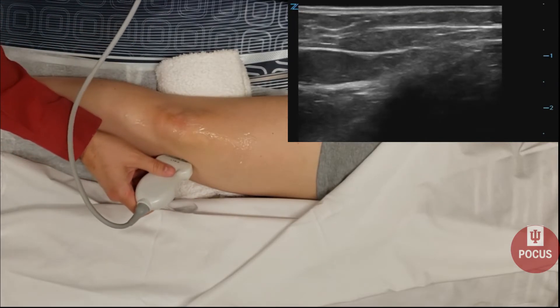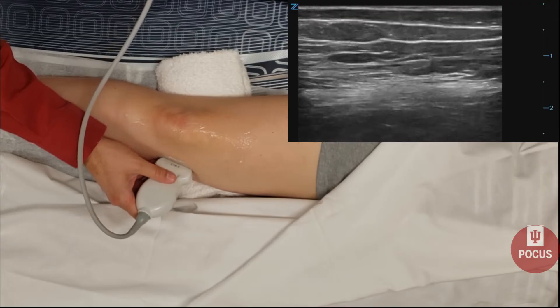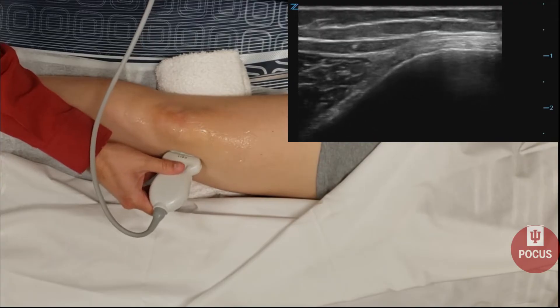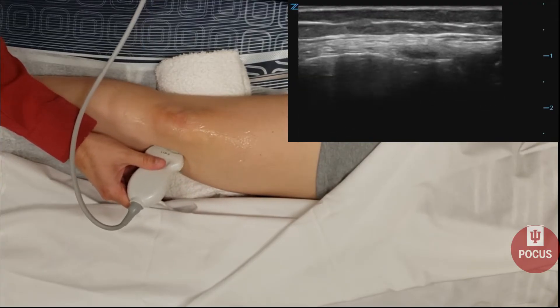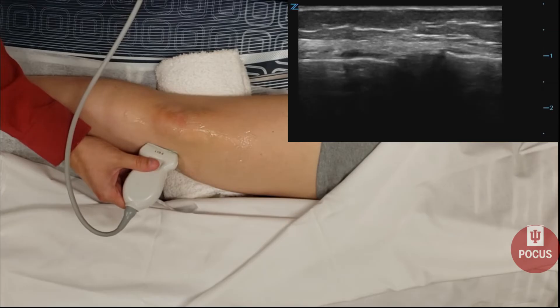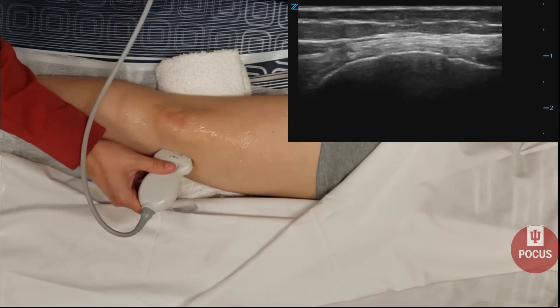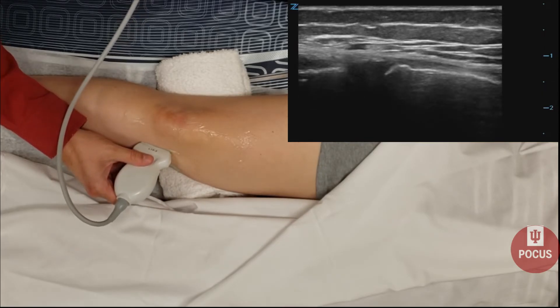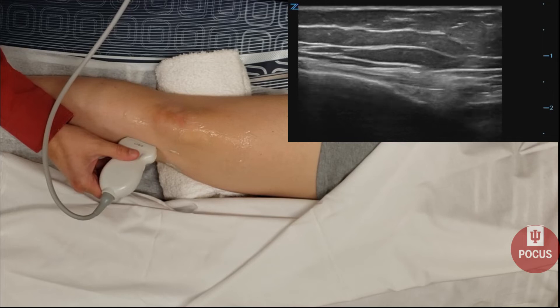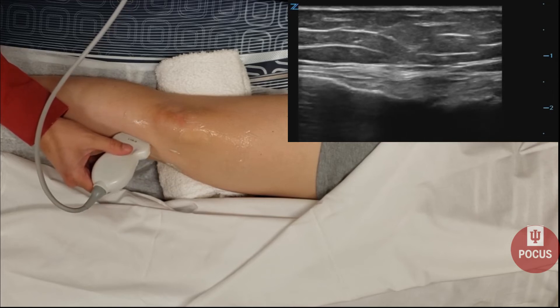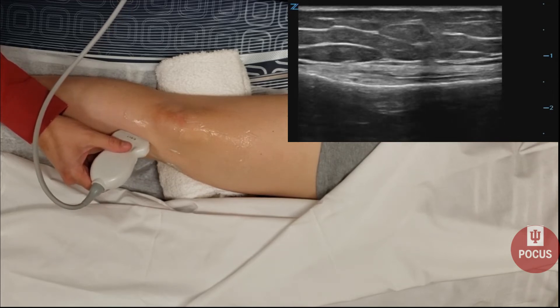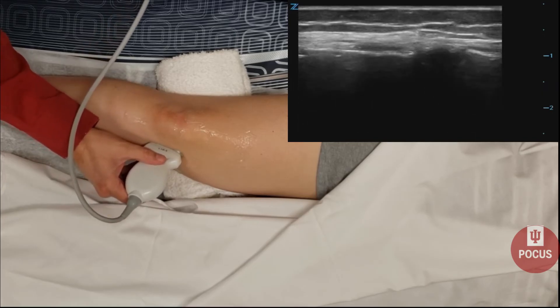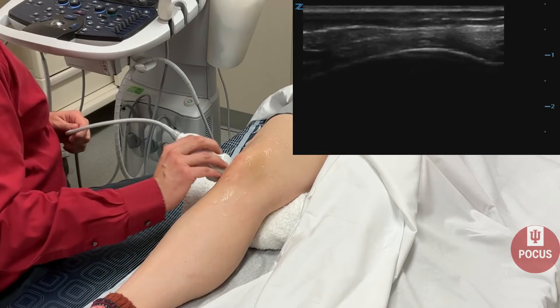Next, we'll look at the medial joint line. I usually like to start at the medial femoral condyle and then follow that distal towards the foot until you see the joint line. You can see the triangle-shaped meniscus there. Often patients will have smaller irregularities of the cortex, the bone on the medial femur, especially if they're runners. You can follow down to the pes anserine and the medial collateral ligament and follow that along proximally as well.